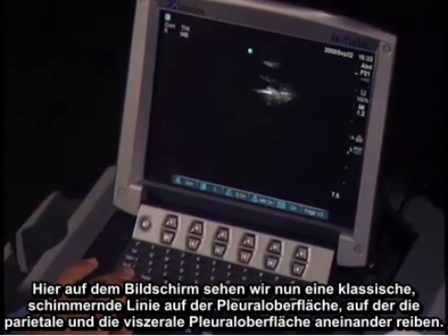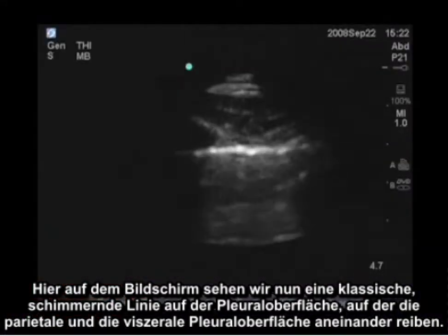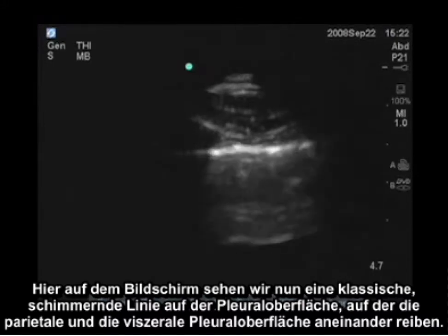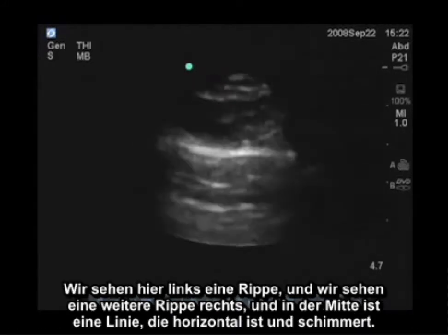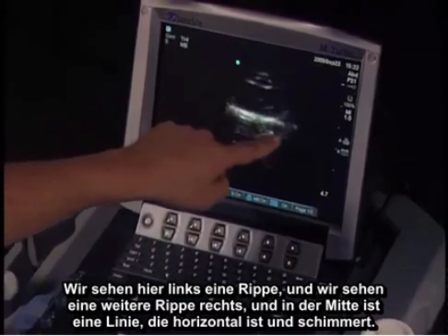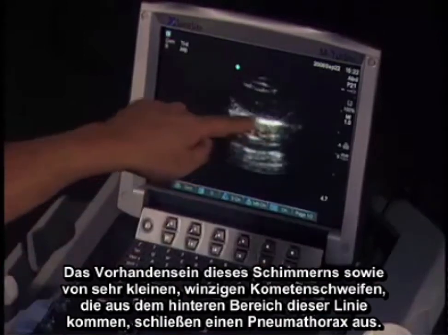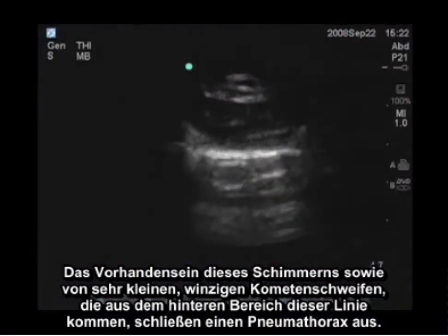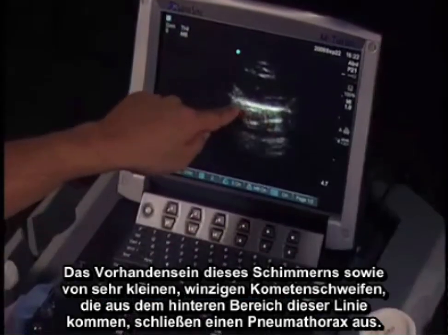What we're looking at on the screen is the classic shimmering line that you see with the pleural surface — that being the parietal and the visceral pleural surface rubbing against each other. We see a rib here on the left, another rib to the right, and in the center is a horizontal line where we see shimmering. The presence of that shimmering, as well as very small tiny comet tails coming from the posterior aspect of that line, excludes the presence of a pneumothorax.